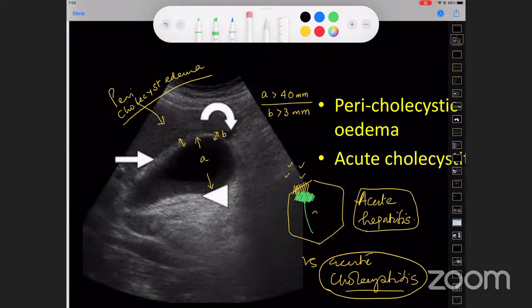Believe me, theoretically, we may shrug away that no, these are different pathologies. Not exactly. In an emergency presentation, both of these are common encounters, and then we have to talk with our radiologist. Okay, so how do you distinguish between these two, and is there any confusion and overlap?